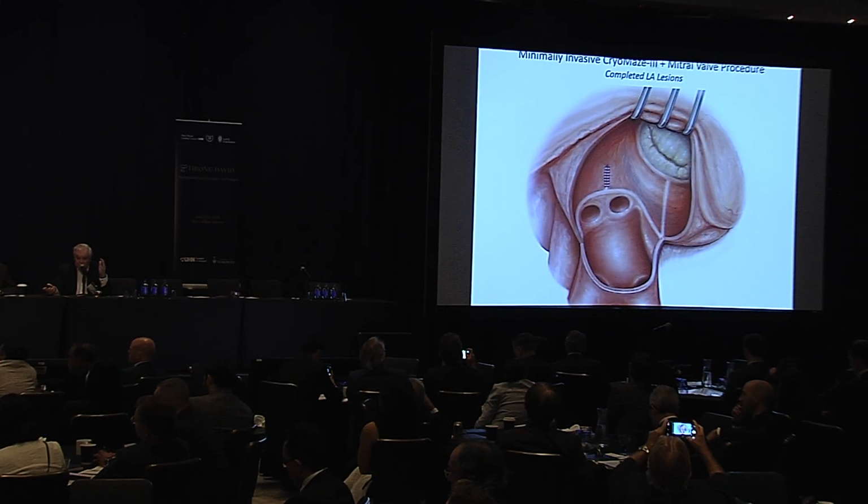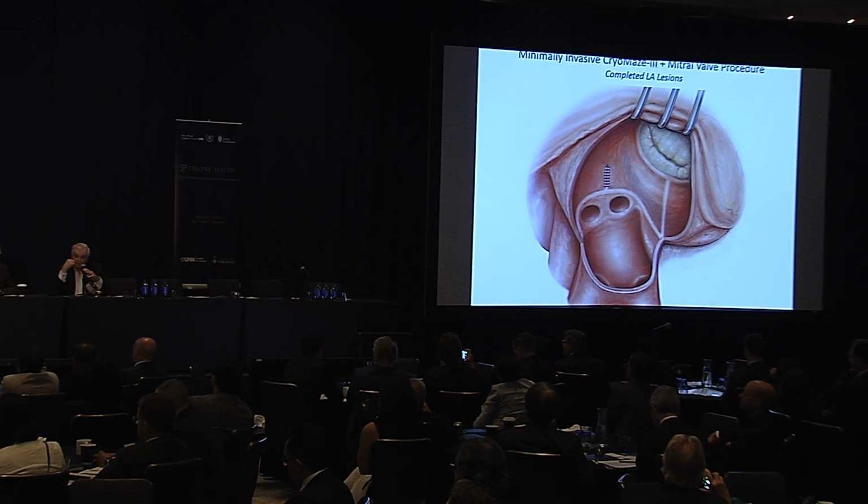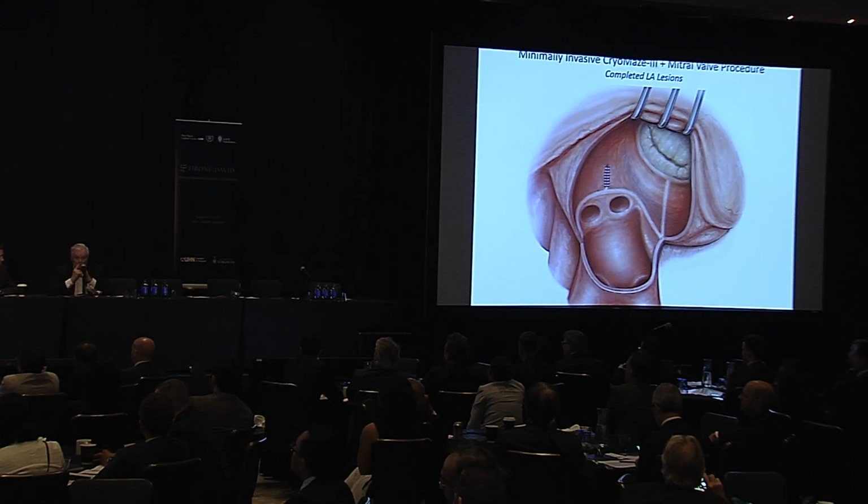Close the atrial appendage up, as we talked about earlier today, and I'll repeat it for people who couldn't see me sitting at the desk. The atrial appendage is like the mouth. When it's open, it's more round or oval. When it's closed, it's a straight line. Same way with the atrial appendage. If you were going to close your mouth, sew your lips together, you would never do it this way. Okay? So you shouldn't close the left atrial appendage this way.